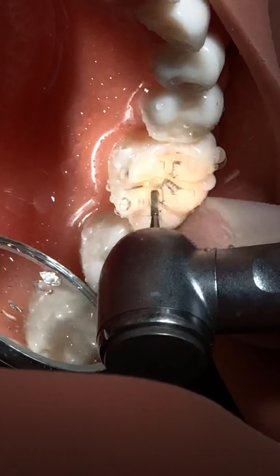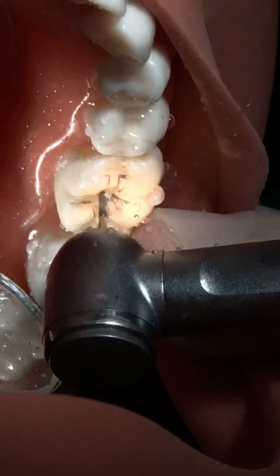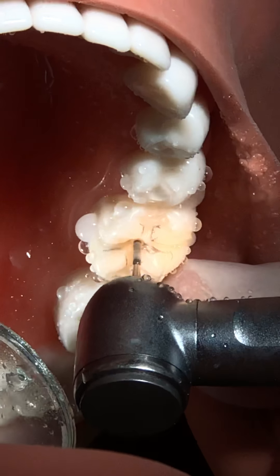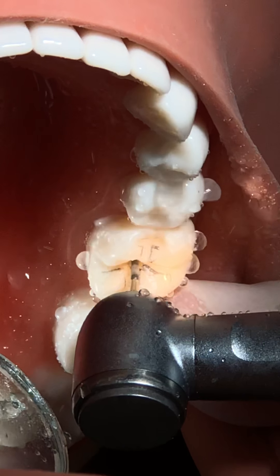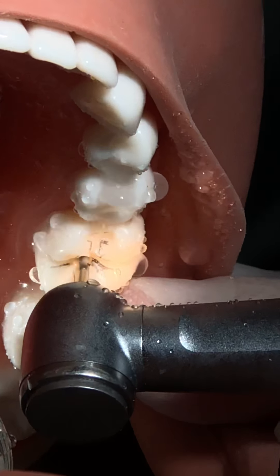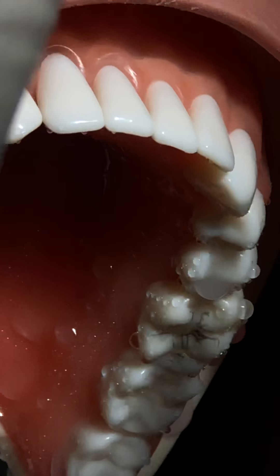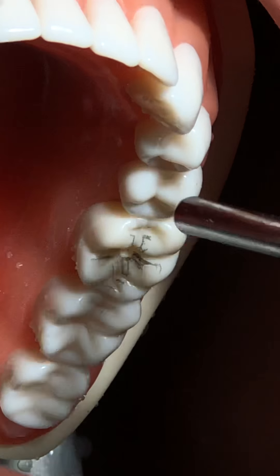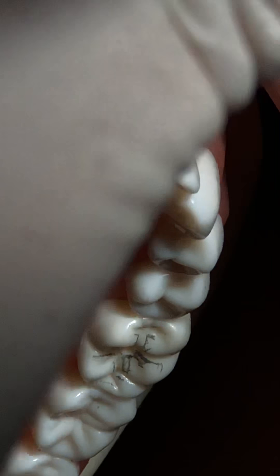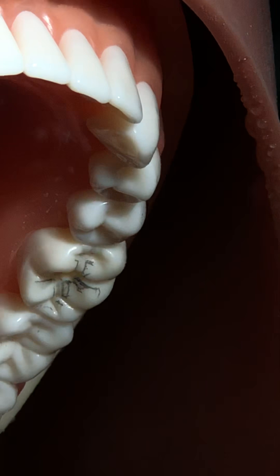We will start in the center - the depth of the bar is seemingly one-third. I'm doing intermittent forces, not continuous cutting. If you do it continuously it will burn, and even with a water spray you will be doing uncontrolled cutting, which will lead to too much removal of normal tooth structure. This is the central pit where I prepared the cavity.